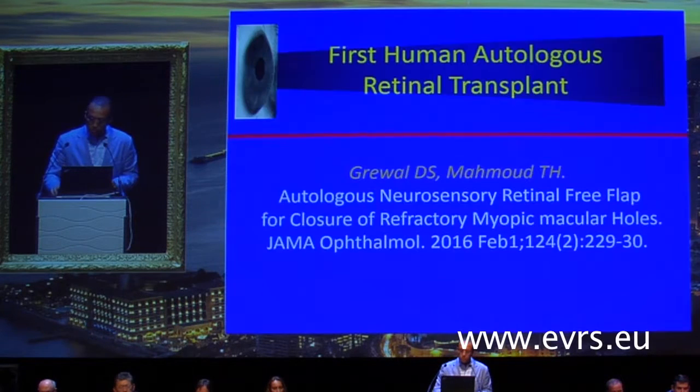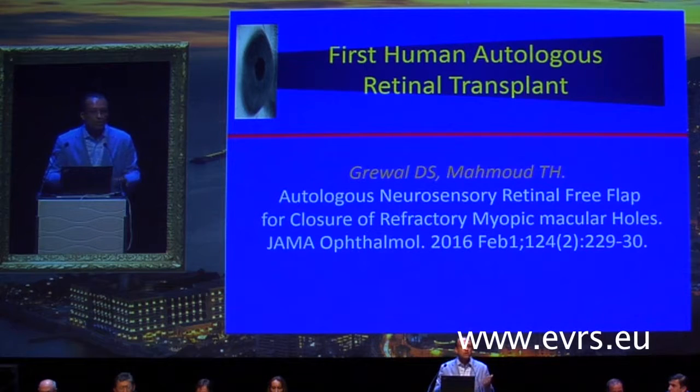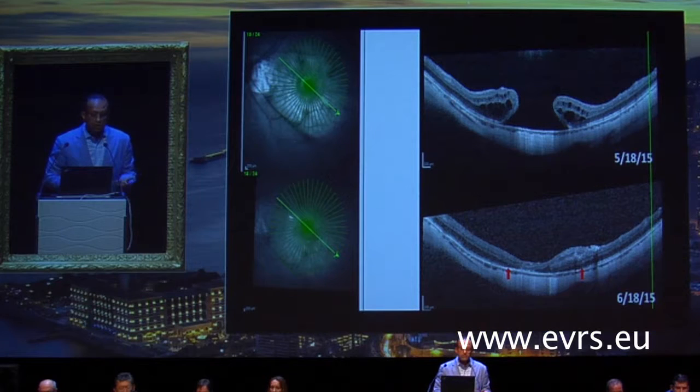So we published this a few months back, and I presented at Vail. So what? I didn't think much of it. You plug the hole, you put retina, plug the hole, another option because you can't have ILM. But what was very surprising to me were the morphological and functional changes in the retina after we did this.